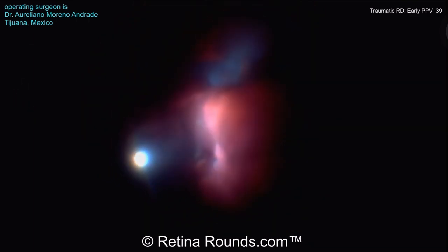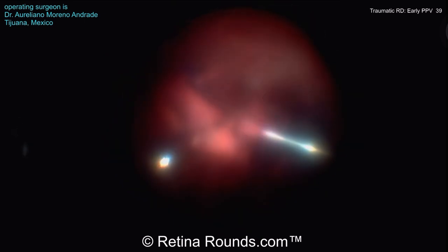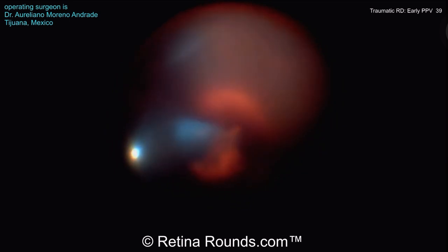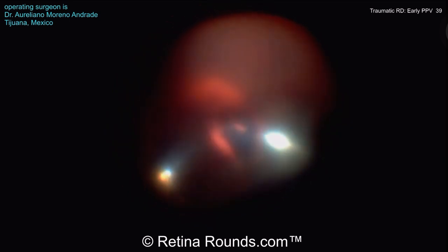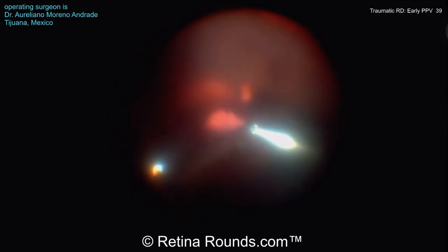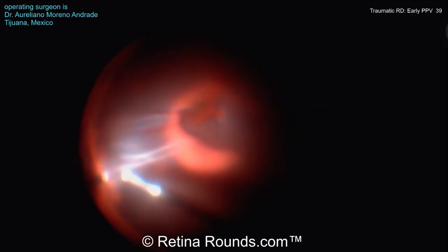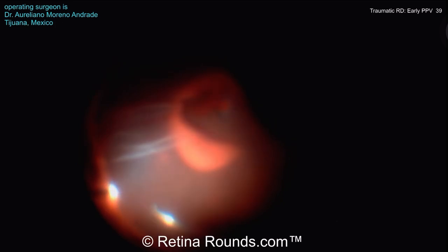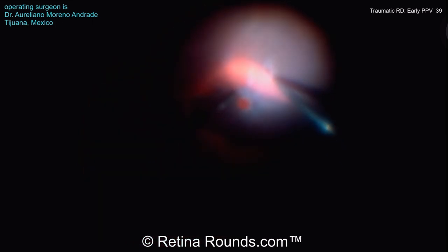And this membrane here, is that retina or is that vitreous? Well, if you look carefully, you'll see that there aren't any vessels. And so that is a good sign that he's engaging the posterior cortical vitreous here. And again, moving very slowly, this is important to make sure that one is in the right anatomic plane and not potentially engaging retina, trimming the vitreous peripherally.